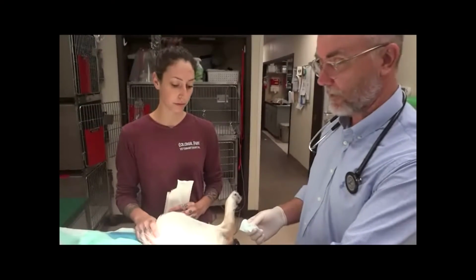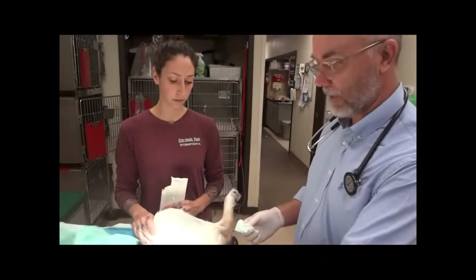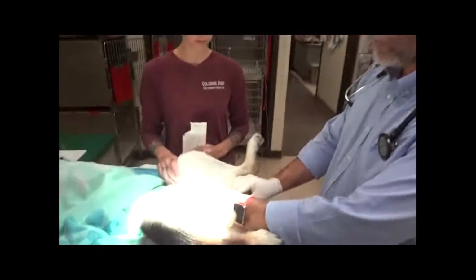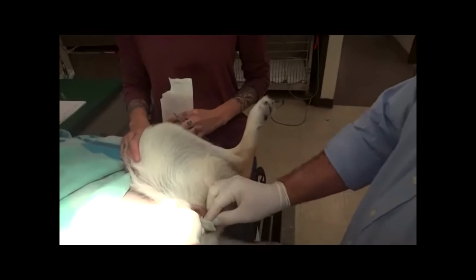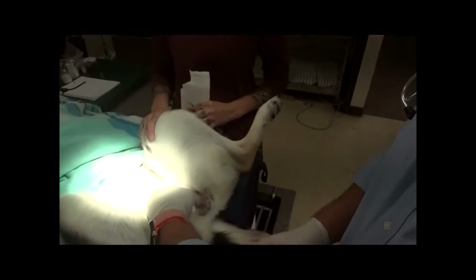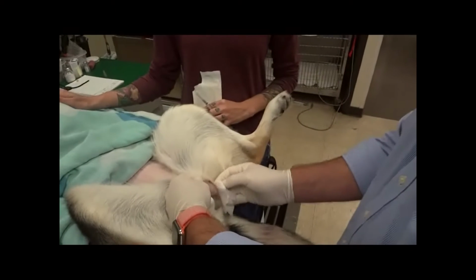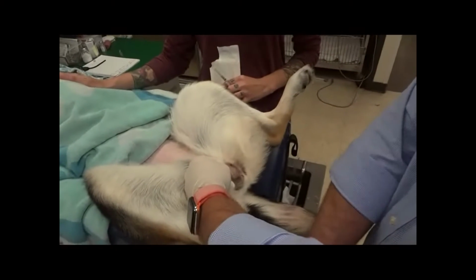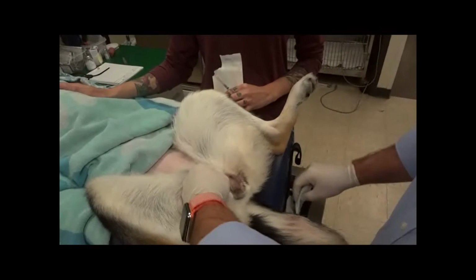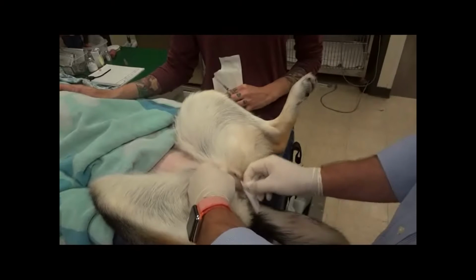I'm going to do a vaginal cytology on this female that's in heat. First we're going to do a chlorhexidine scrub of the external genitalia, followed by an alcohol scrub, alternating in between those two. Get off any bacteria that we could introduce into the lower reproductive tract, although there's already going to be some bacteria probably in that particular part of the anatomy.